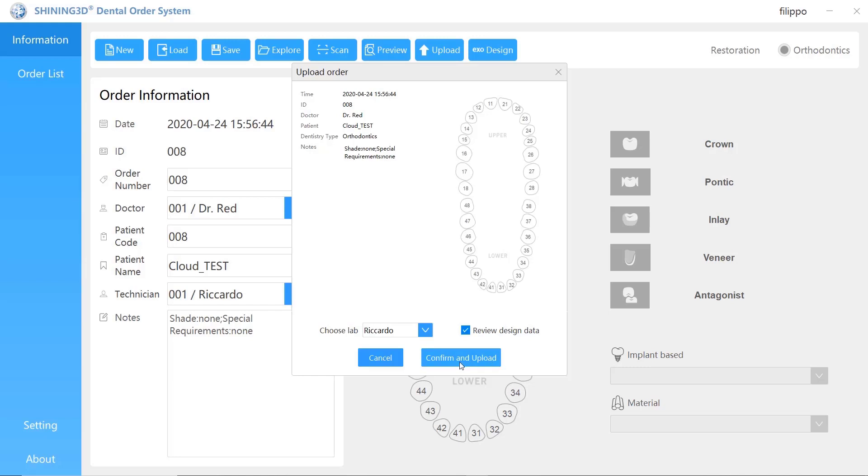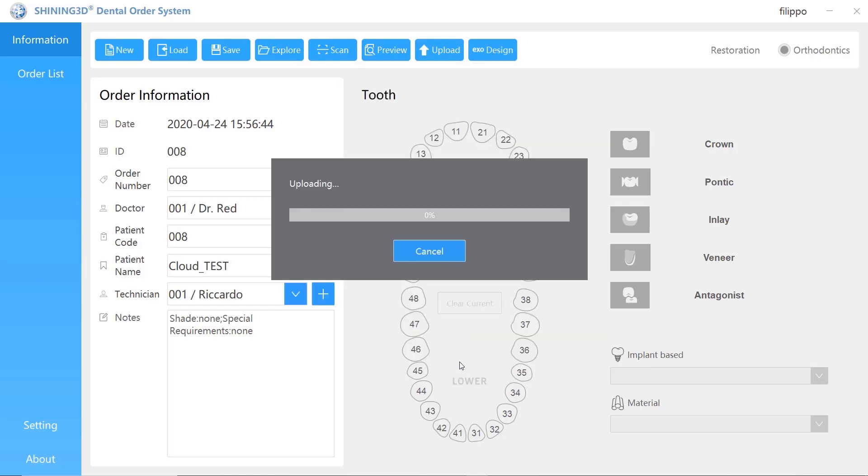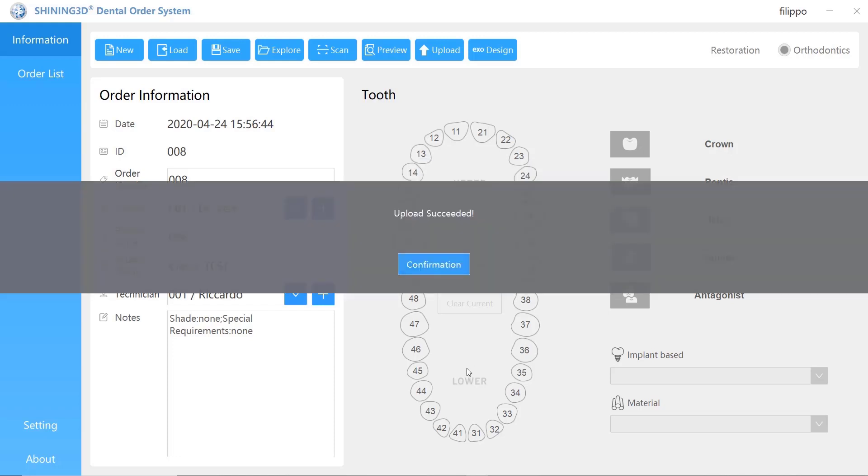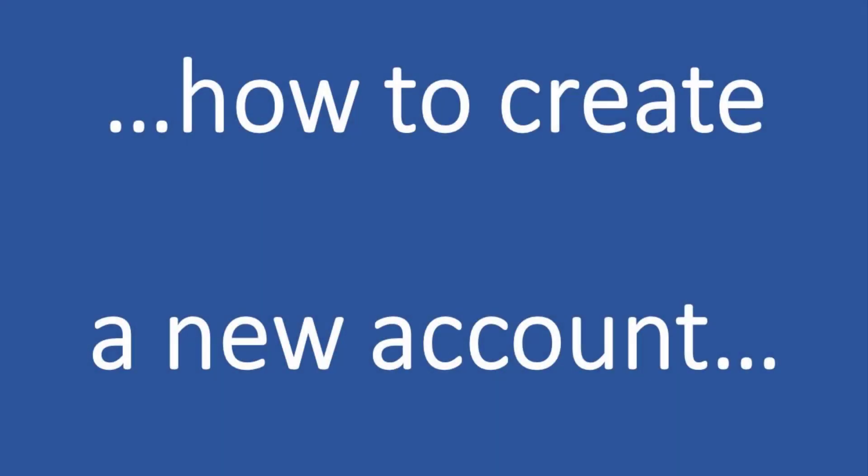Once completed the upload process, the receiver, I mean the dental lab, will receive an alert on their email plus an SMS on their mobile phone.